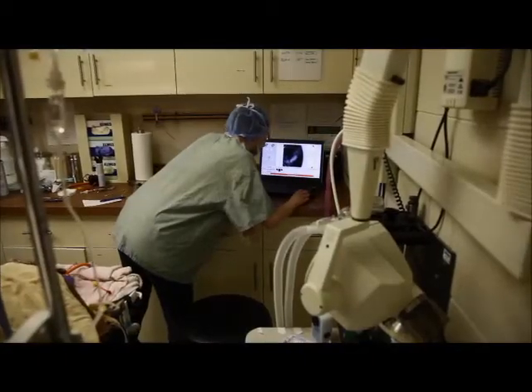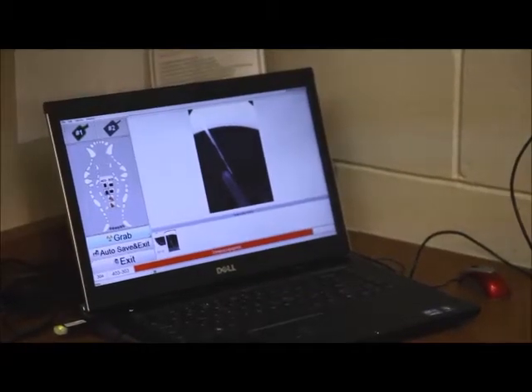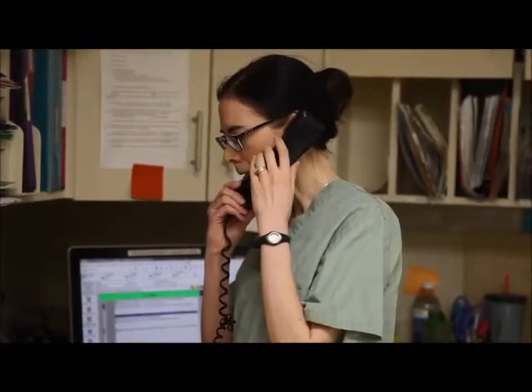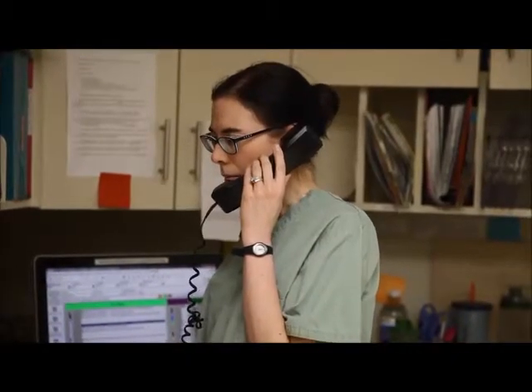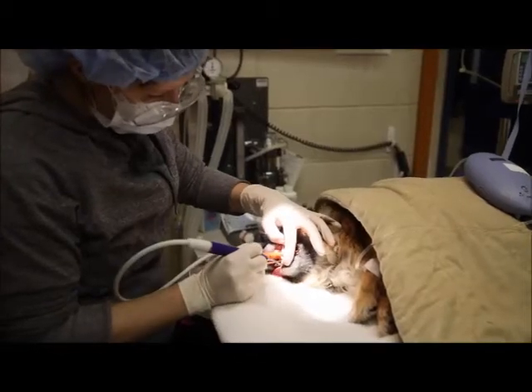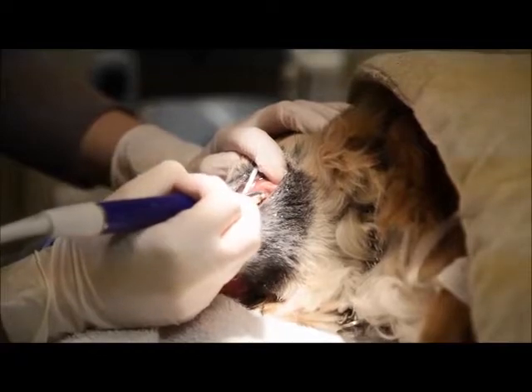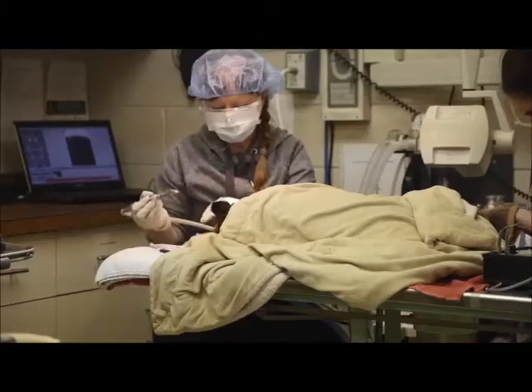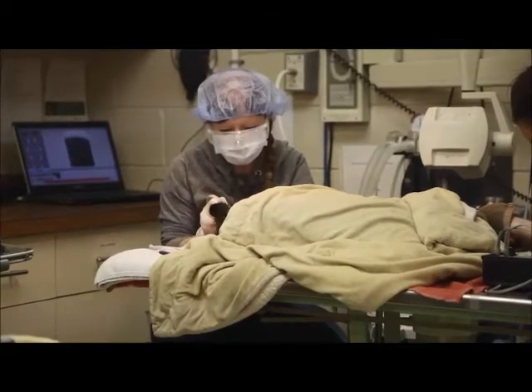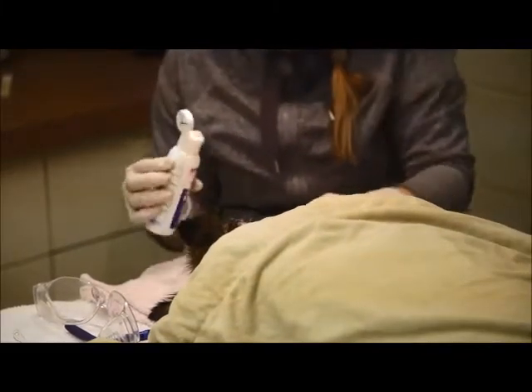The doctor then assesses all this information and makes a decision about oral surgery, including possibly extractions of teeth that cannot be saved. If this has not been discussed with you in advance, the doctor will call you to explain your options. Meanwhile, the nurse, who is trained much like a dental hygienist, will perform a careful and thorough cleaning. The little pockets under the gums are also cleaned, which is a critical step. The teeth are then polished, not to make them look shiny white, but to make the surface smooth so that it attracts less plaque. Then finally, a fluoride treatment is administered to strengthen the teeth.